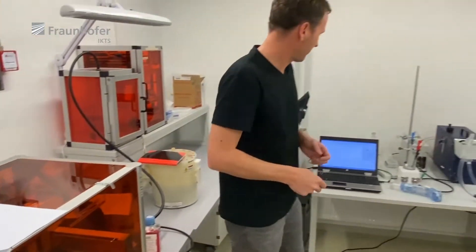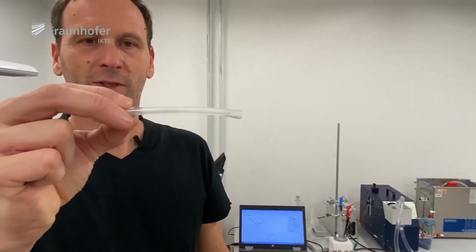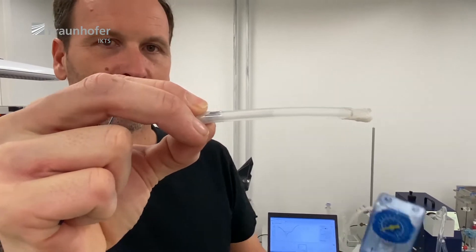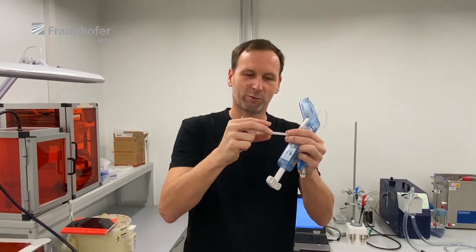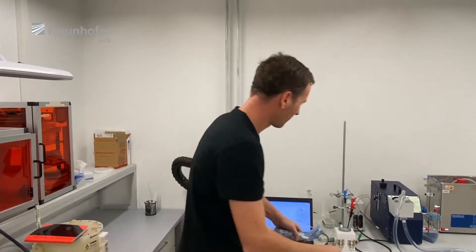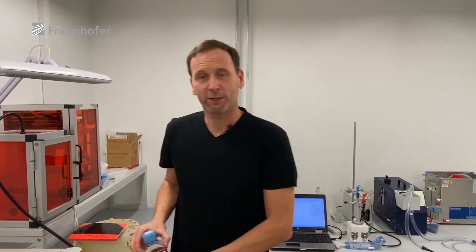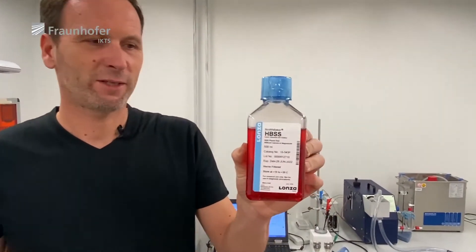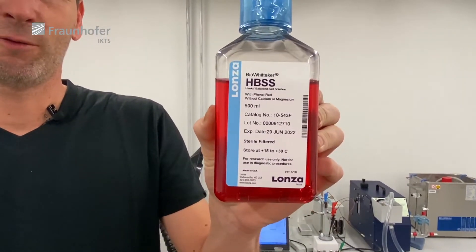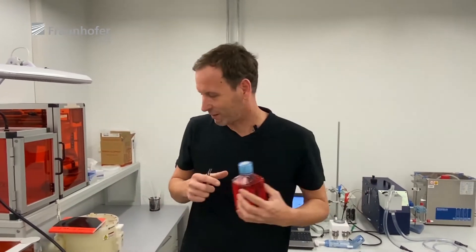To test the stents, we apply them into a silicon tube using a high-pressure syringe to expand the stent so it won't move anymore. The stent has to be exposed to some kind of solution. We don't use blood — we use a Hanks balanced salt solution, whose chemical properties are close to blood. It's not exactly like blood, but it's close.